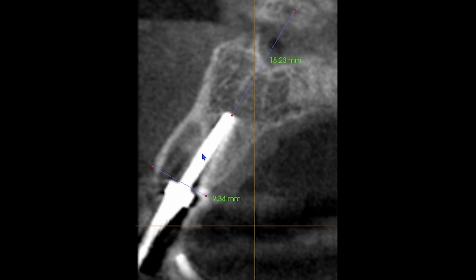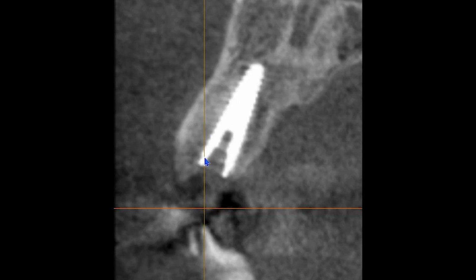Notice this one. This one's right dead center of the bone, and the final restoration is a little bit more palatally situated as far as its exit point, but that's what you want. You want to be coming out the cingulum. So this is perfect placement, and look how that's biting right there into some good bone all the way down. This has great stability, and look at that grafting technique that I showed you by putting the bone in first and then using a Versaburr in reverse, slow dry in reverse. Look how nice and packed that bone is. I get great results with this.